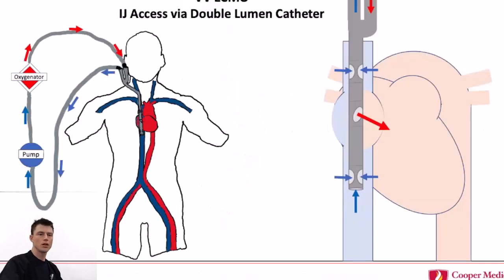Yeah, so just looking back here, we'll talk about how we manipulate the circuit, but sometimes we might have to flow at a very high blood flow rate. And you think about, look at this arrow and where that's shooting that blood. It's going to shoot really high pressure blood right at that right ventricle. It probably isn't used to seeing that effect. And so if we have patients flowing on 5.5 liters a minute, it's really probably not the best thing for the right ventricle. It's not helping, but it may also inhibit its function by pushing all that blood there.